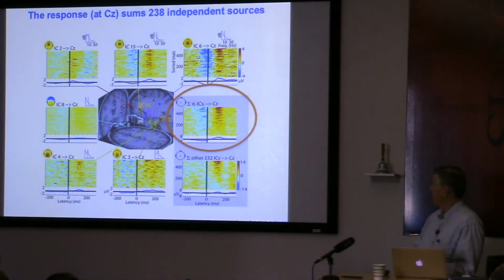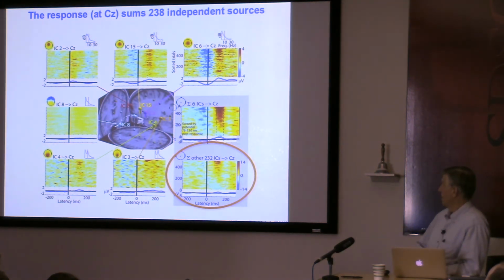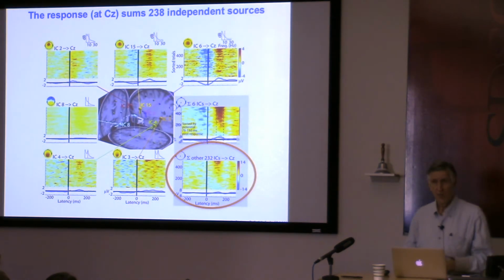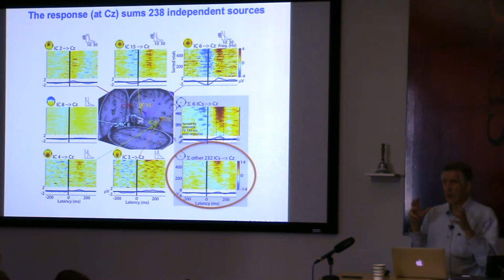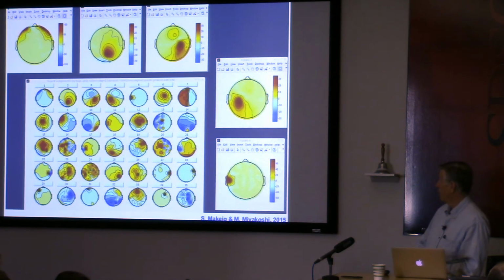Do they explain all of what's going on at the CZ electrode channel? And the answer is no. If you take the difference of those 2 ERP images, you see this. In some trials, there are still other potentials that play a role, particularly in the trials in which there's a large late positive complex. That's why the term complex was originally put in at the same time as P300, and P300 got picked up. But the complex means that there are various things contributing to it.